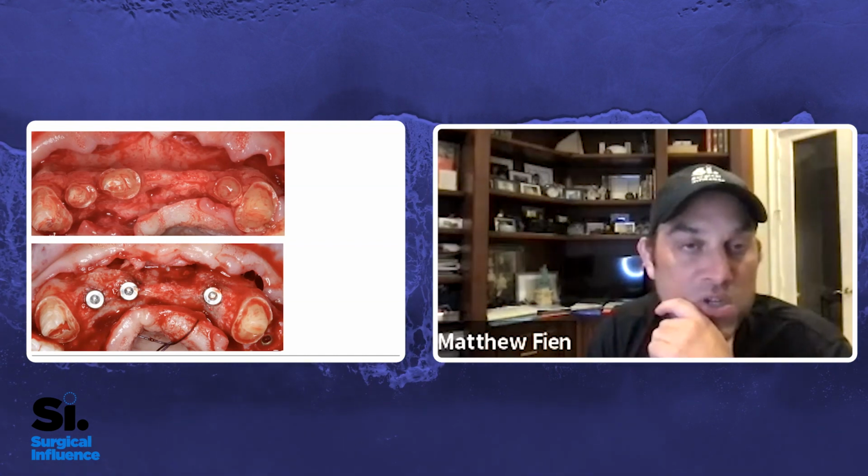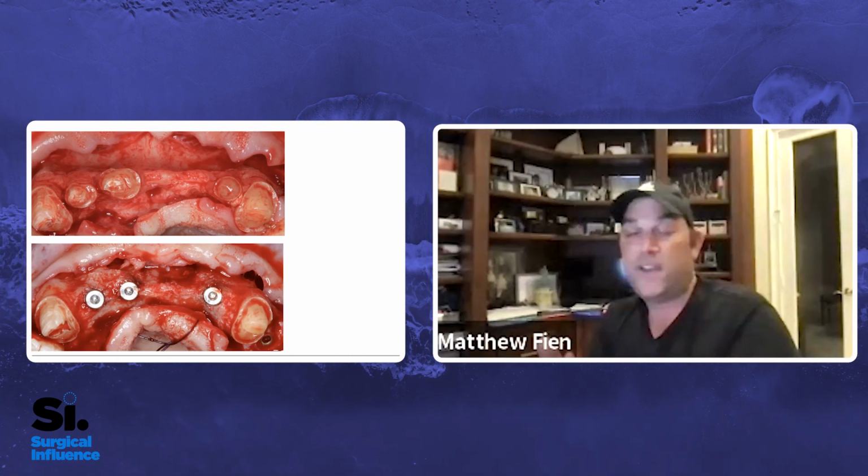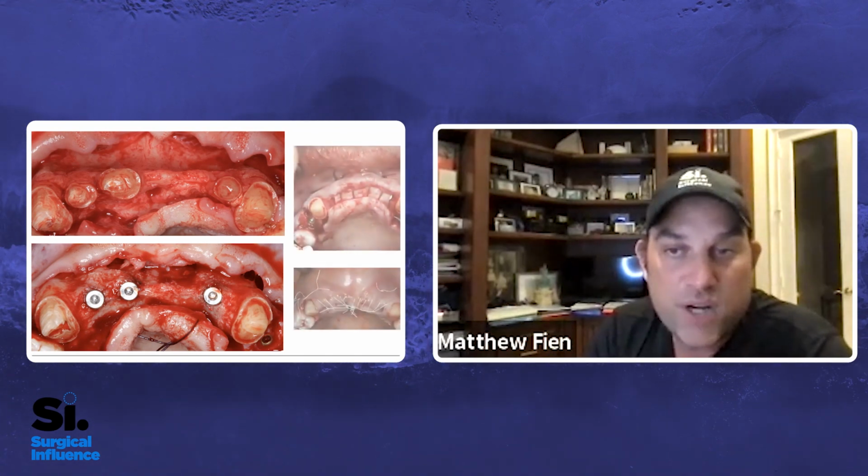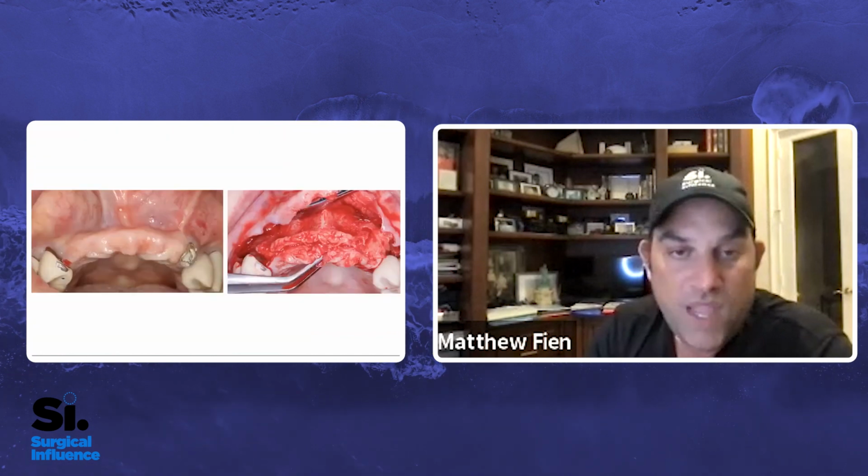And I think in the maxillary anterior it is really huge, which is why for me, that case that Israel showed with the large vertical defect, I still think the titanium reinforcement is not a bad way to go because you need something to resist the lip pressure. And so nothing wrong with not getting everything you needed, right? I went back and I added a little bit more graft. And so we can certainly be successful there.